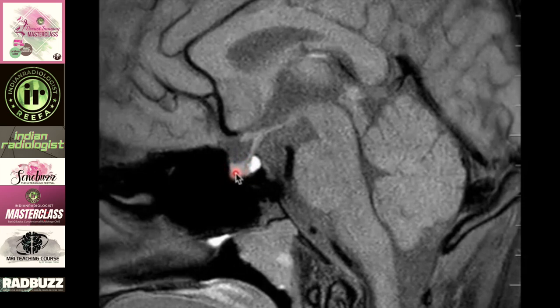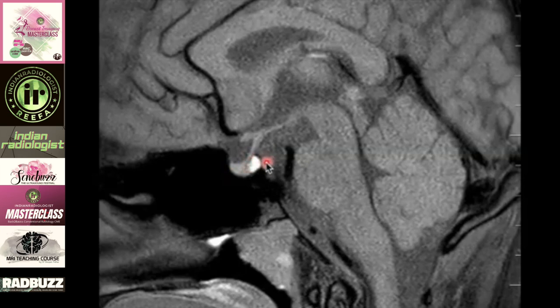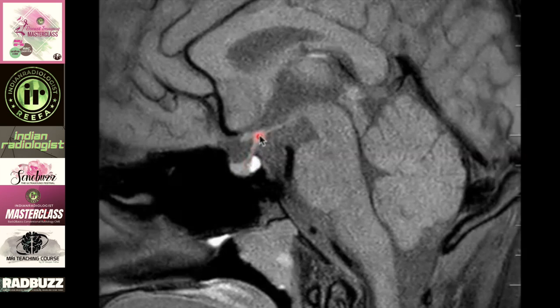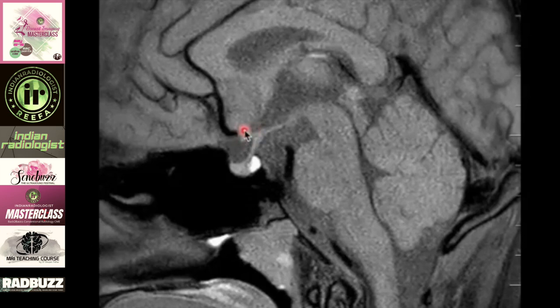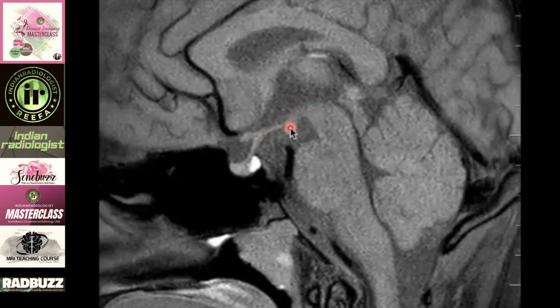The adenohypophysis has a superiorly concave border normally. The height of the adenohypophysis may be increased in physiological conditions like puberty, pregnancy, or the immediate postpartum period. Posterior to the adenohypophysis we see a hyperintensity even on non-contrast T1-weighted sequences — this is the posterior pituitary bright spot. Superior to the adenohypophysis is the infundibulum, above which is the tuber cinereum, the optic chiasm, the chiasmatic recess, the lamina terminalis, and the mammillary body region of the hypothalamus.